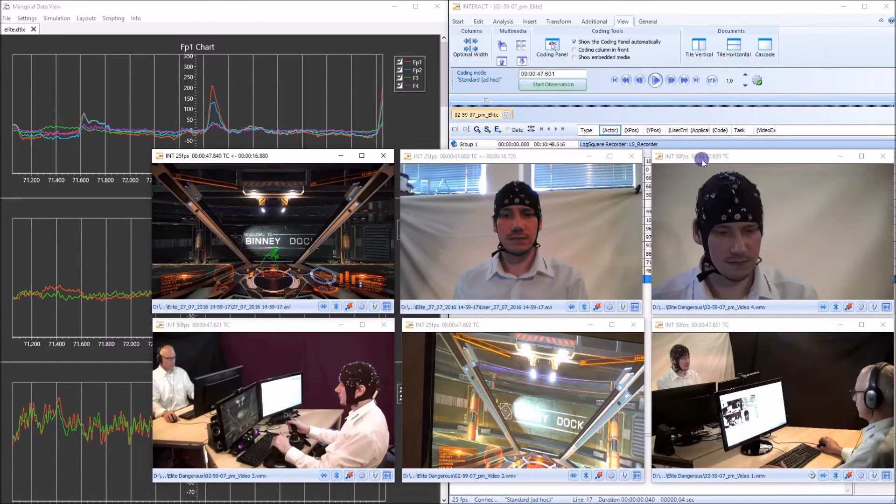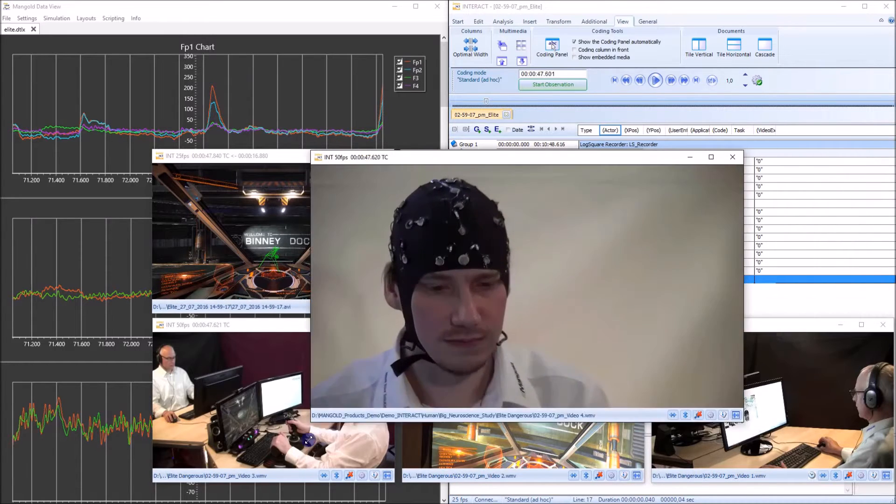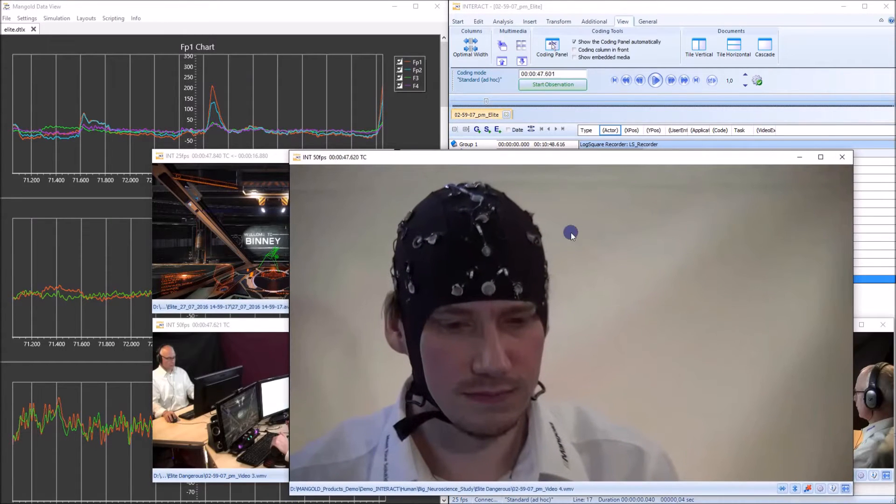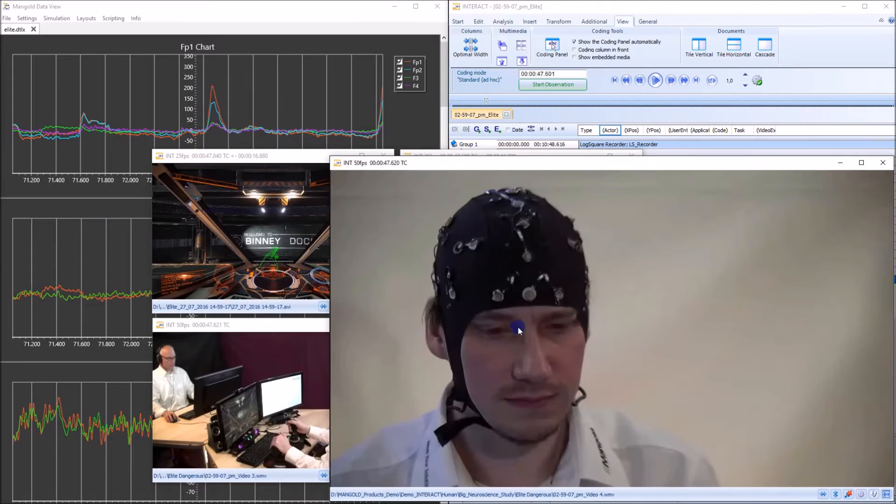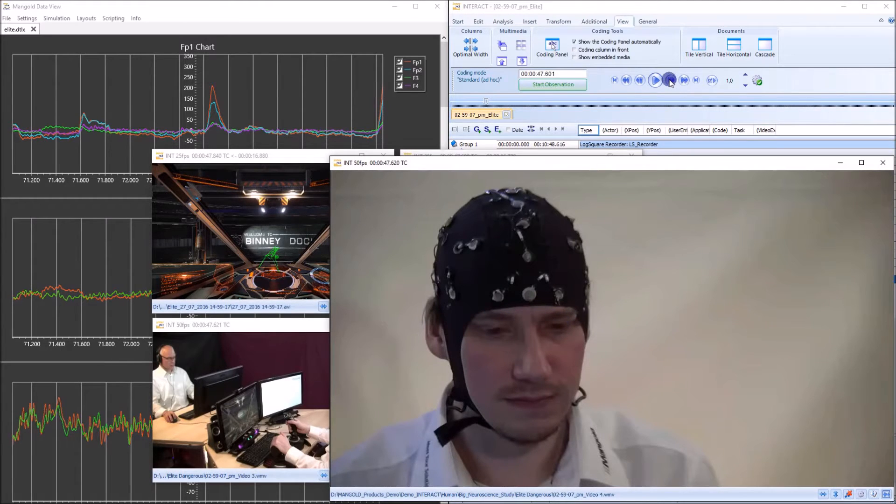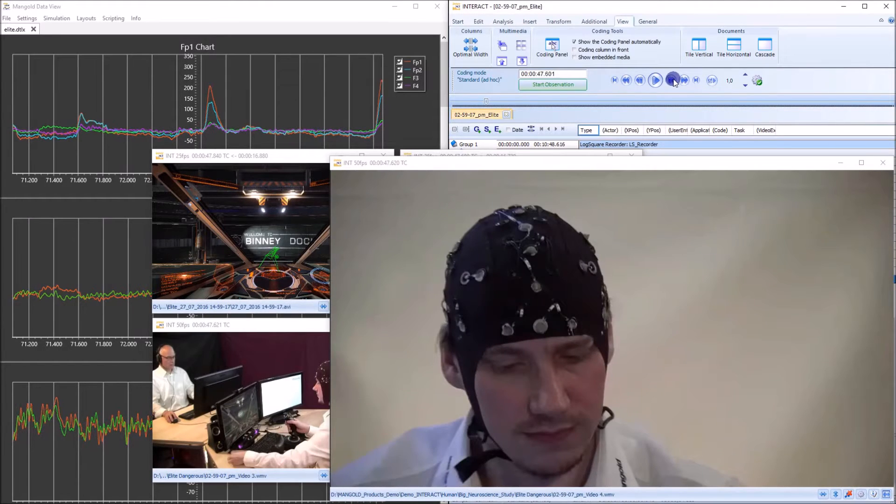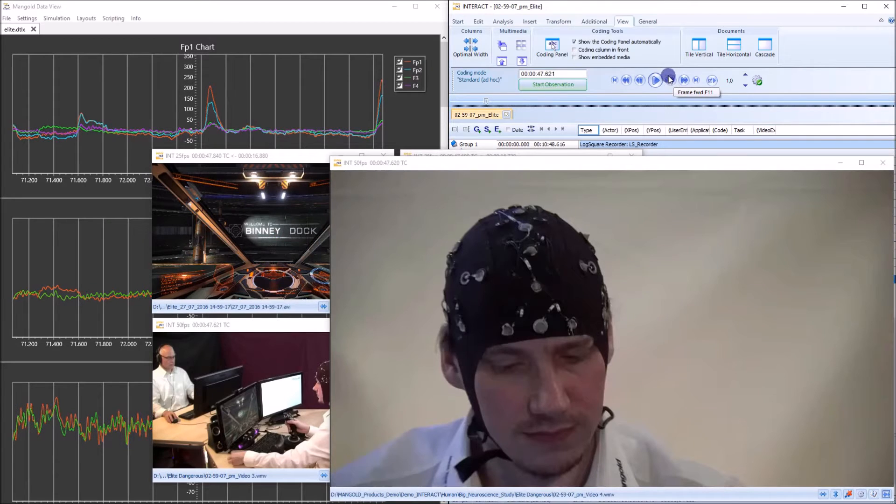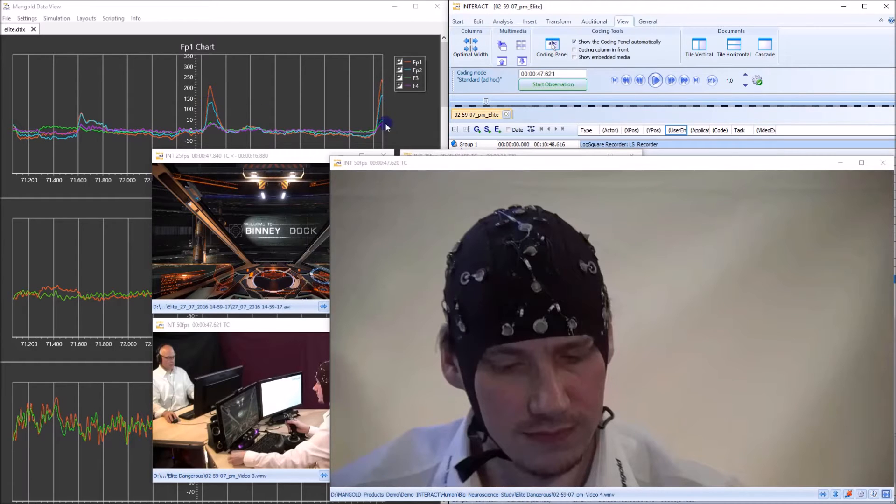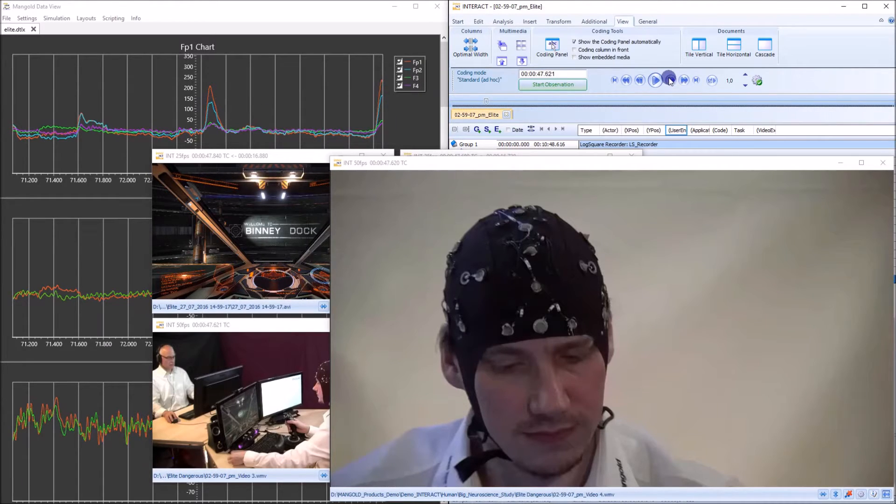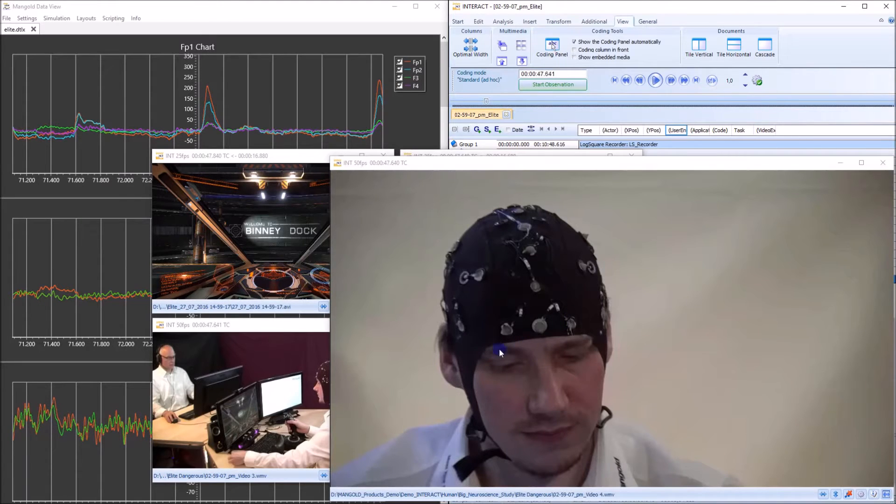Let me take a look at this video here and let's take a close look at the eyes of the participant. Now I control in interact my videos frame by frame and the data in data view stays in sync because as I said they communicate with each other. Now let me go forward here and take a look at the eyes of the participant.